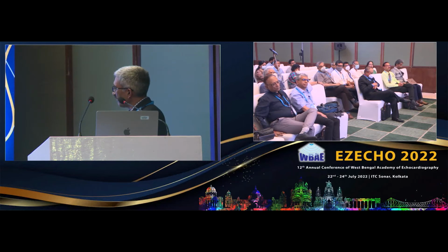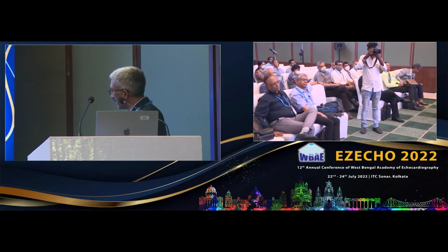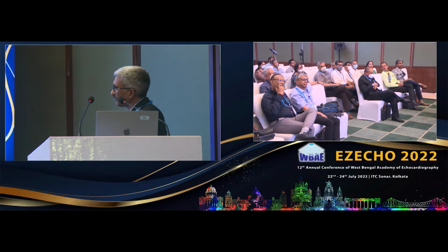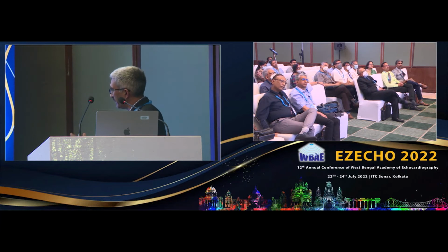The ability to evaluate for the volumetric changes with free breathing is in progress, is something that we can do on some newer software, but is still not something which is routinely done. But we can certainly use free breathing sequences to evaluate those patients. We also have some very fast sequences which are typically acquired in about 3 to 4 seconds, or less than 3 to 4 seconds. And at that speed of acquisition, you can minimize the motion that we get within the ventricular wall.